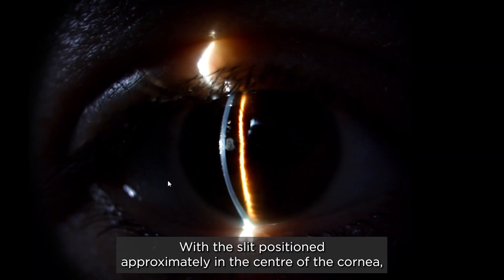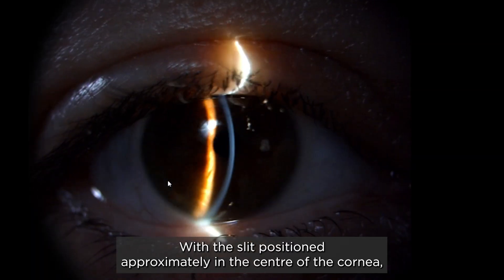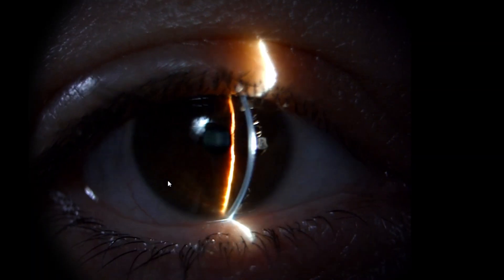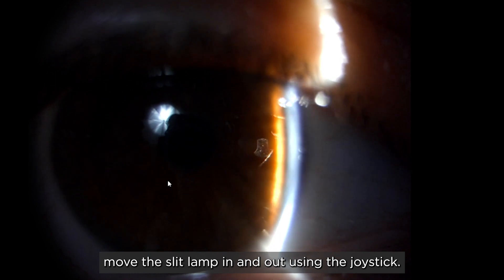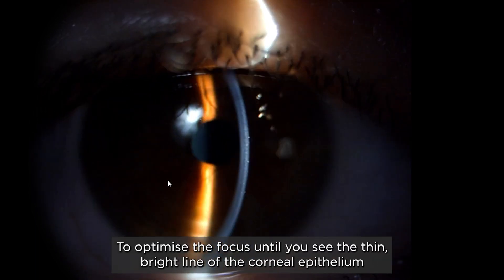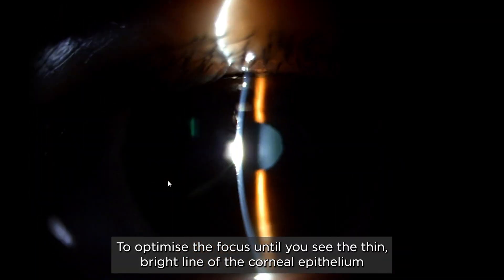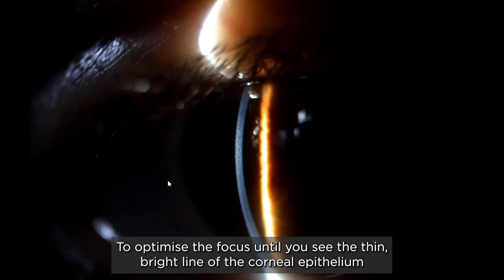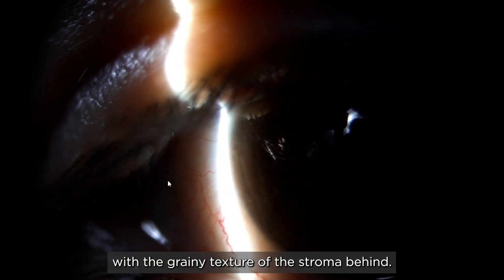With the slit positioned approximately in the center of the cornea, move the slit lamp in and out using the joystick to optimize the focus until you see the thin bright line of the corneal epithelium with the grainy texture of the stroma behind.